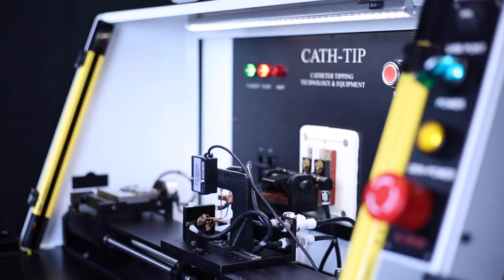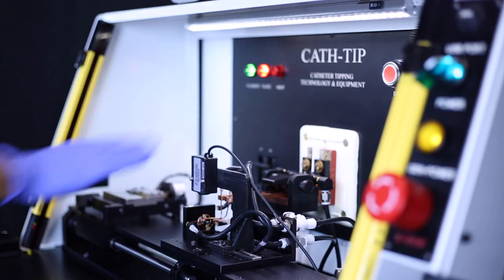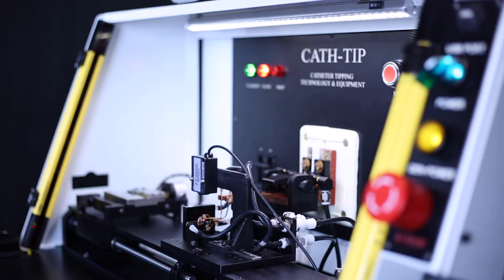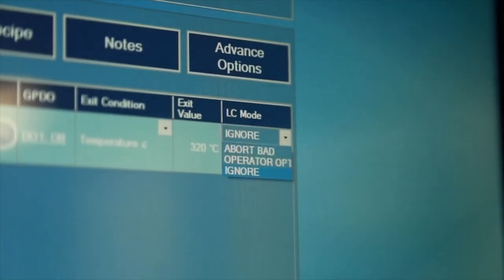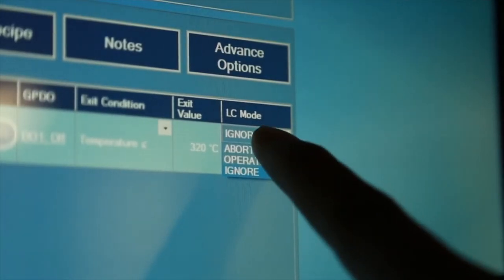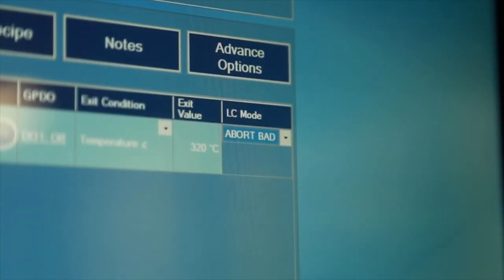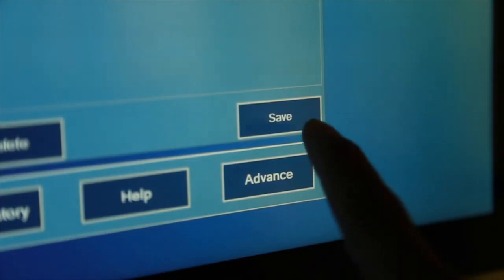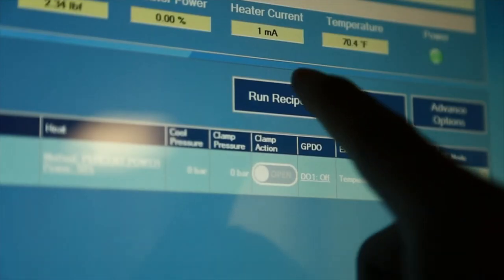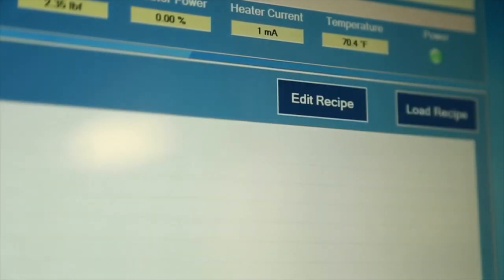Then, choose what happens when the light curtain is tripped. Abort bad cycle, operator option, or ignore. Make sure to save or run when complete.